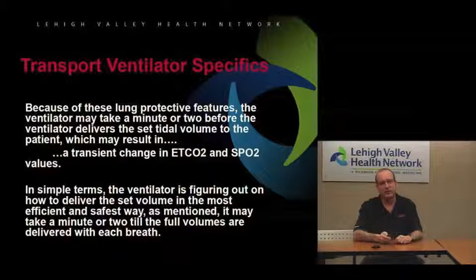And actually on the 1200s, as long as you're not high pressure alarming, that patient's going to get what you set to deliver, unless they actually hit their alarms.